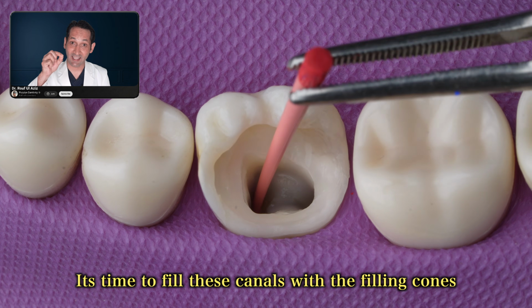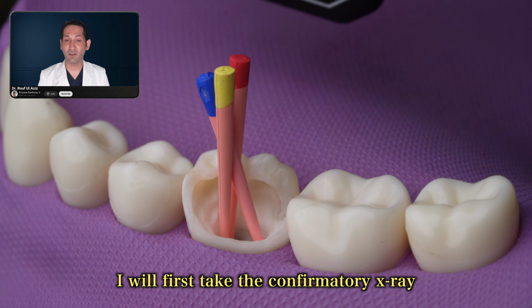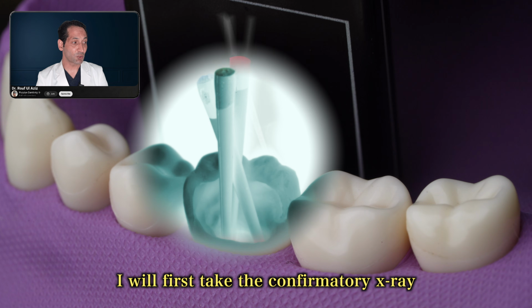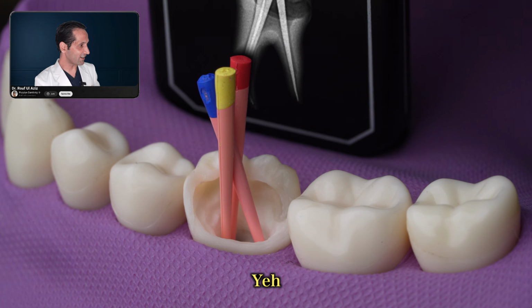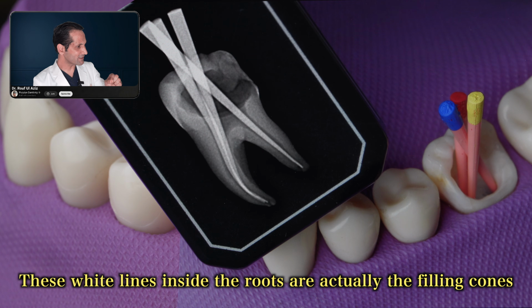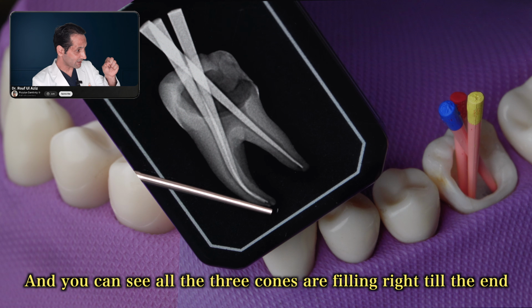It's time to fill these canals with the filling cones. But before permanently filling the canals, I'll first take a confirmatory X-ray to check whether these filling cones are reaching right till the end. Yeah, here it is. These white lines inside the roots are actually the filling cones, and you can see all three cones are reaching right till the end.